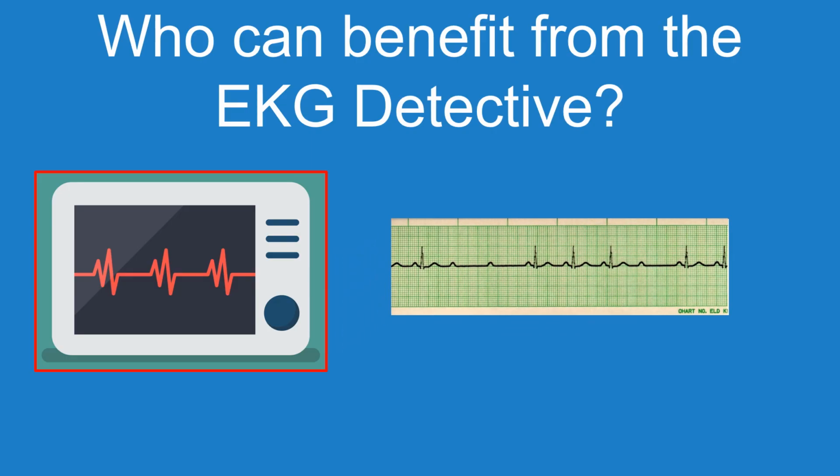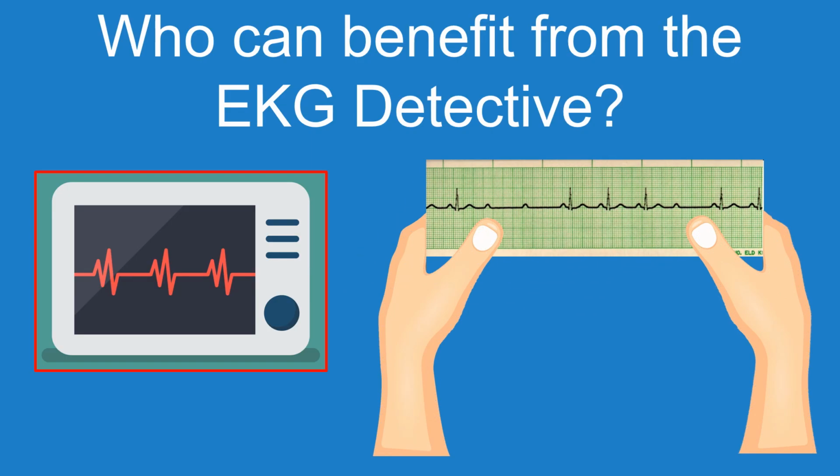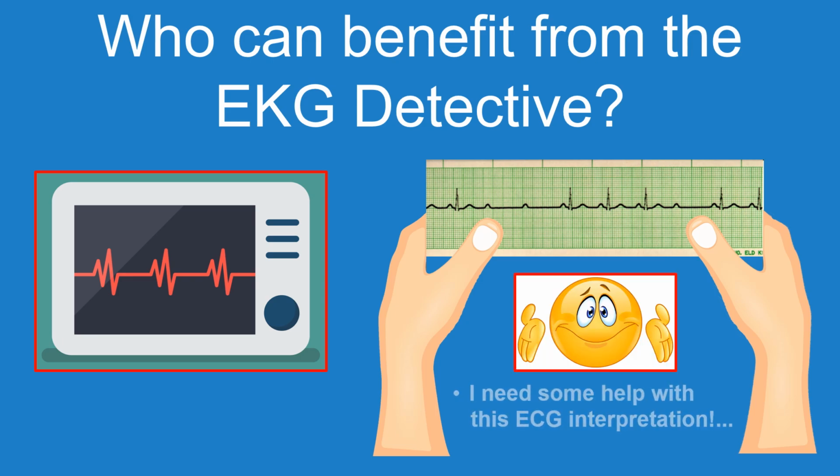So the biggest question to ask is who can benefit from using EKG Detective? And the answer to that is anybody who is struggling with an ECG interpretation. The nice thing about this process is it allows you to focus on the waveforms and the things that you can see in the ECG, and you don't have to spend as much time focusing on the criteria within an ECG.